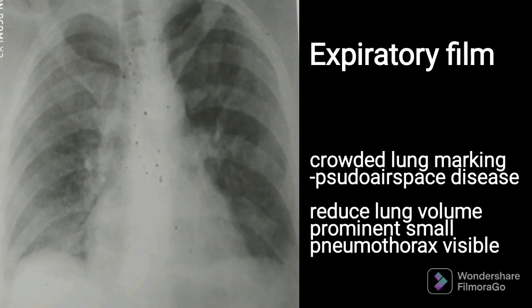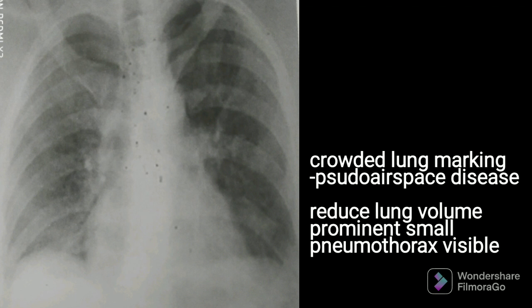In an expiratory film, crowded lung markings are seen because it is taken in expiration — less air is present inside the lungs. So crowded lung markings may mimic a pseudo airspace disease. There is also a benefit to this expiratory film: one use is in pneumothorax, because the reduced lung volume in expiration can more easily show a small pneumothorax.